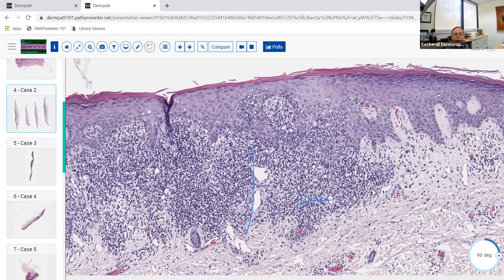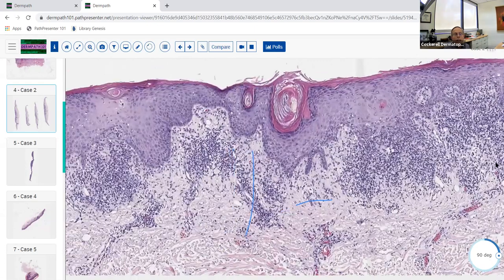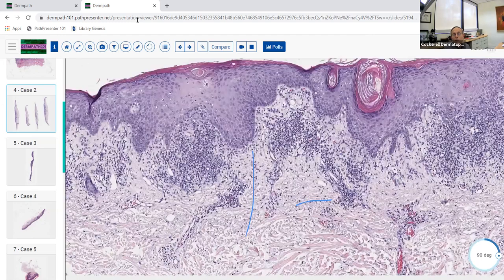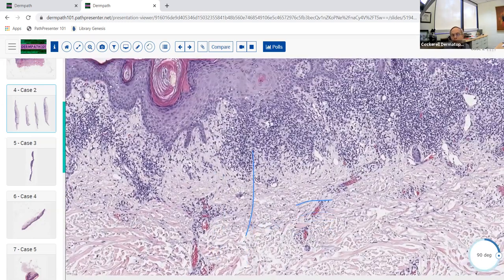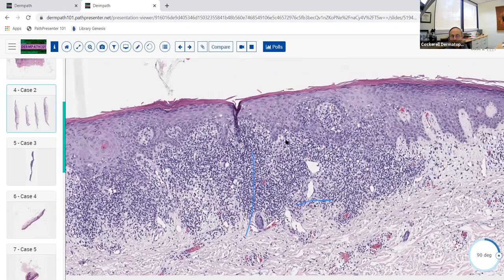A benign lichenoid keratosis is basically a macular seborrheic keratosis or solar lentigo that gets an inflammatory infiltrate of lymphocytes developing a lichenoid pattern. Without clinical context, you might think about lichen planus because it can look very similar. BLK usually doesn't give eosinophils - mostly lymphocytes. You can get necrotic keratinocytes and colloid bodies with BLK just like lichen planus. The key is seeing the macular seborrheic keratosis, horn pseudocysts, and other changes off to the side. Clinically these are usually submitted as rule-out basal cell carcinoma.